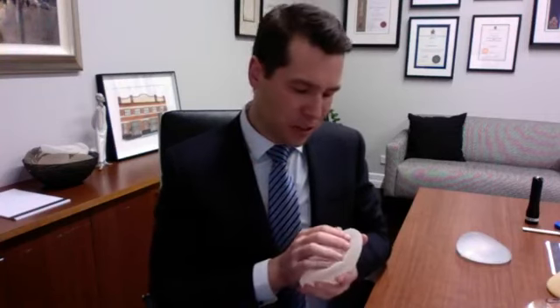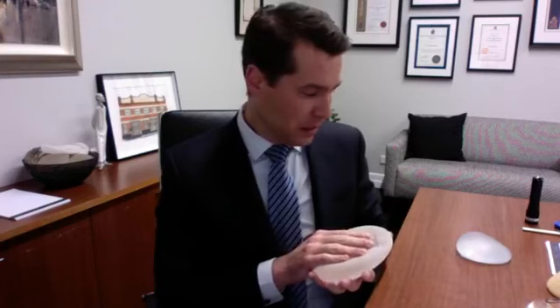A lot of us were also moving away from using the Allergan implants, which may have had an impact on their business. But yeah, it's mainly down to the research as to why I imagine they recalled their textured implants. What about other implant brands? We haven't had many other macro-textured implants actually on the market that we as specialist plastic surgeons in Australia have been using.